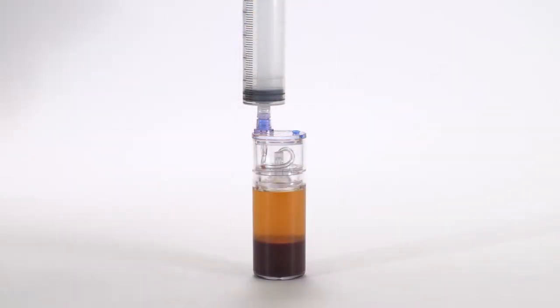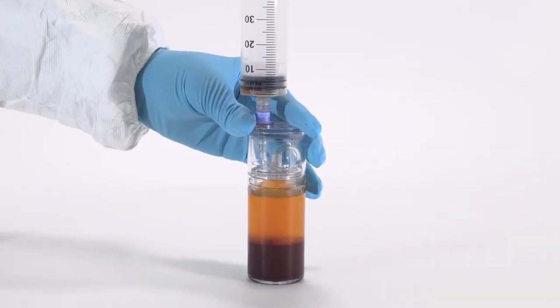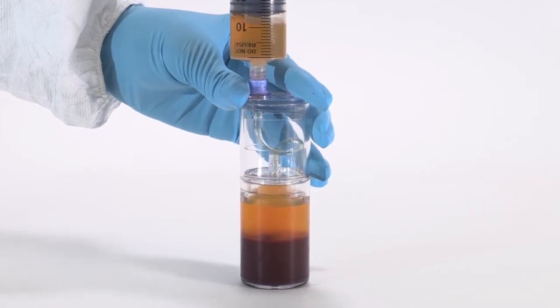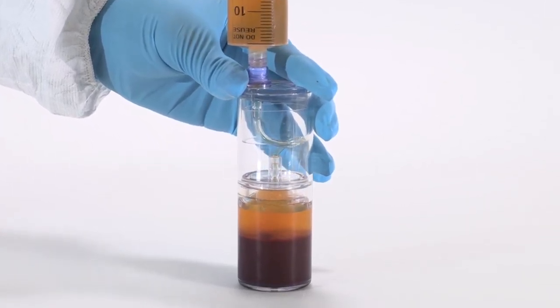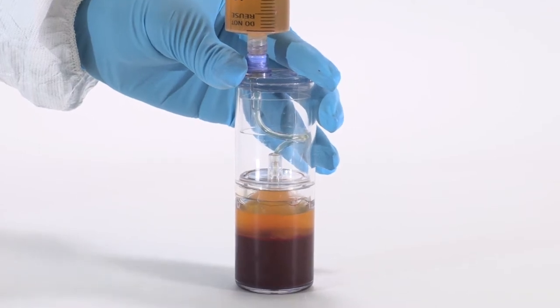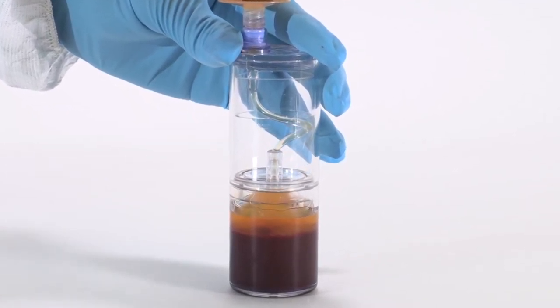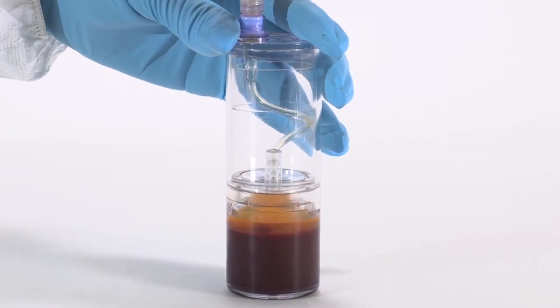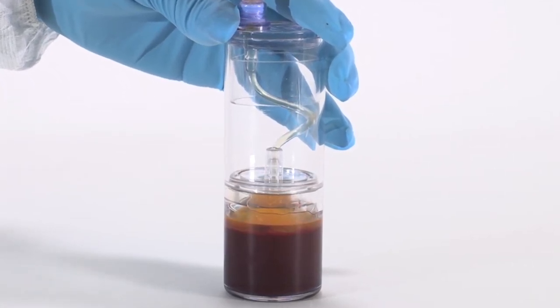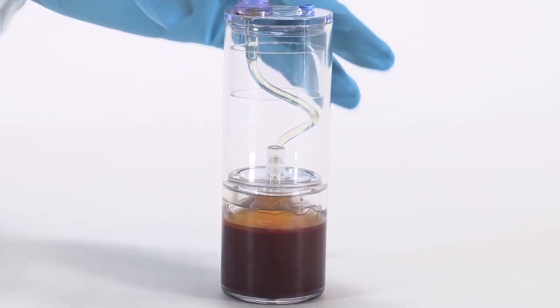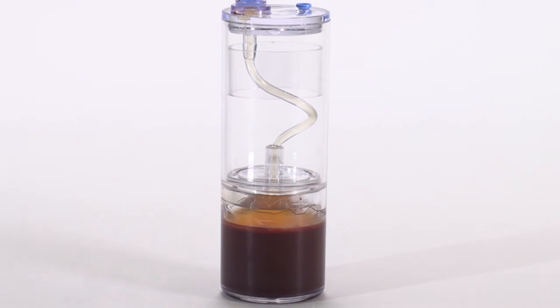Attach the sterile 60-milliliter syringe to the needleless port and aspirate the plasma. Aspirate until the piston meets the red blood cell layer, then stop aspirating. This traps the plasma and platelet buffy coat in the cone of the piston.